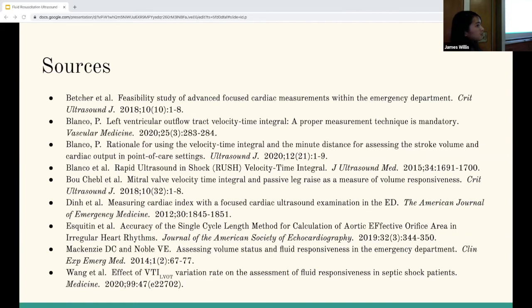Yeah, I mean, like most ultrasound research, unfortunately, it's either so simplistic that it's trying to validate itself by definition. Oh great, we have this great thing where we measure VTI changes, and we have a proven change in cardiac output. Okay, of course, by definition, I got the cardiac output. So either that's useless, or they go too far with it and try to extrapolate: with the VTI change, our outcome measurement was mortality change. Wait a minute, is that really why we're doing this? Do we expect a real change in why people are dying or not? Or are there different outcomes in between those extremes that you can look at instead?